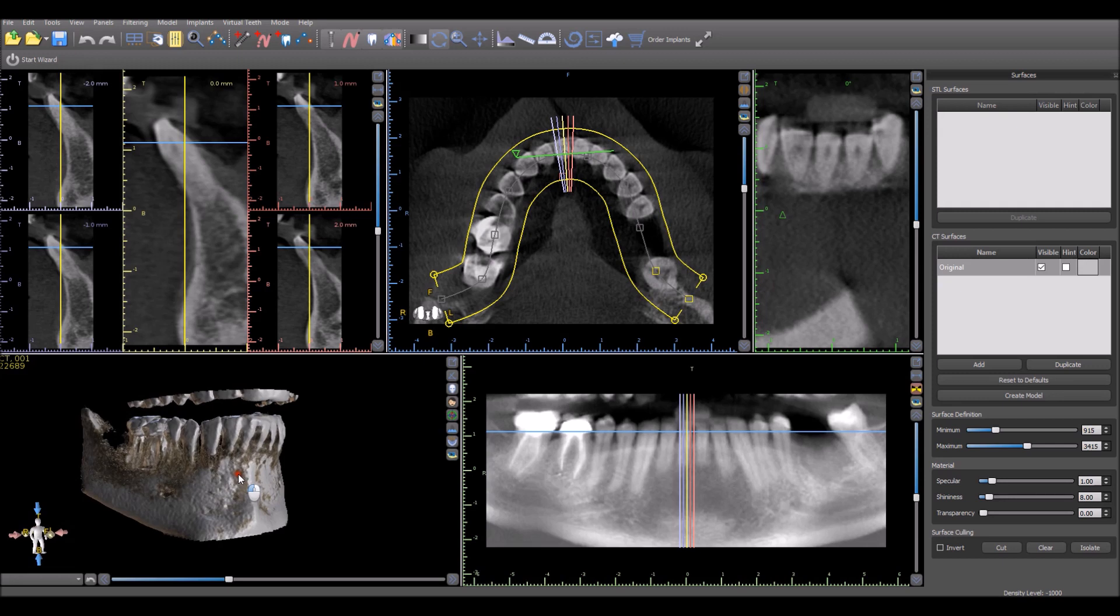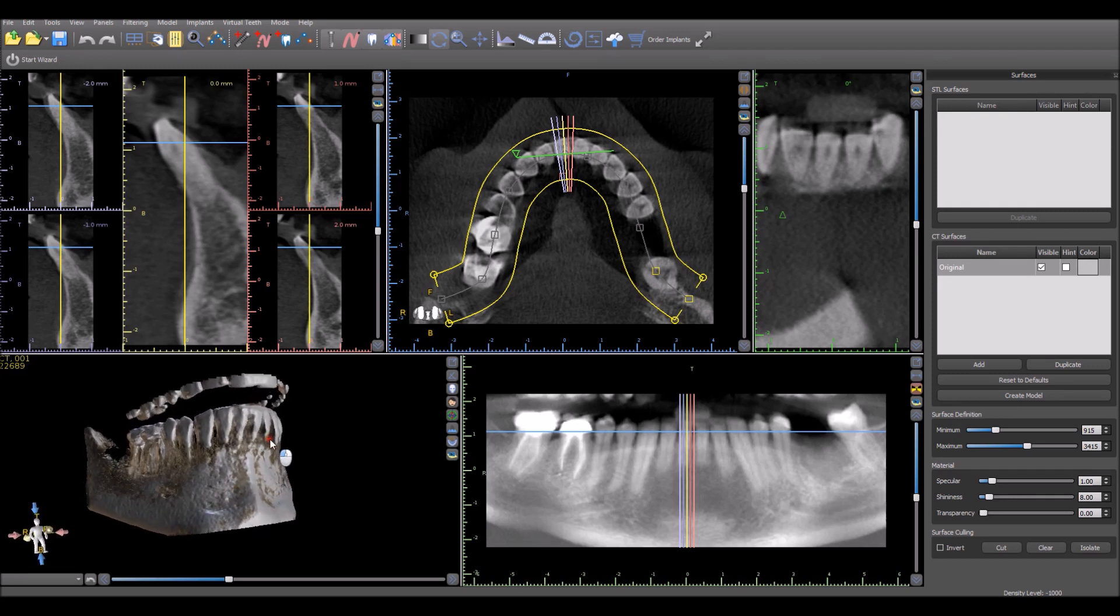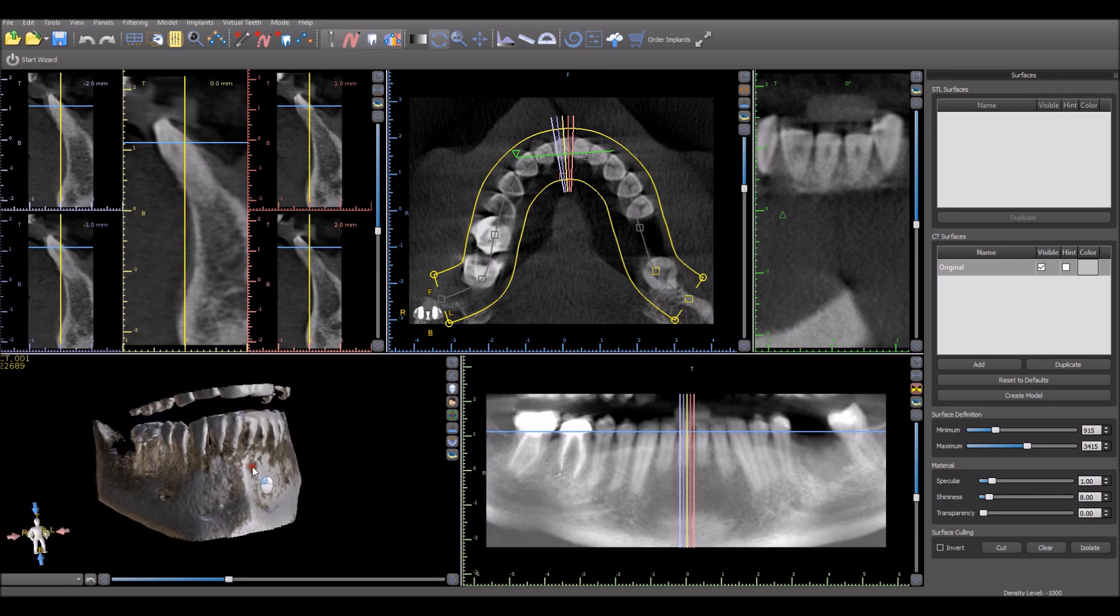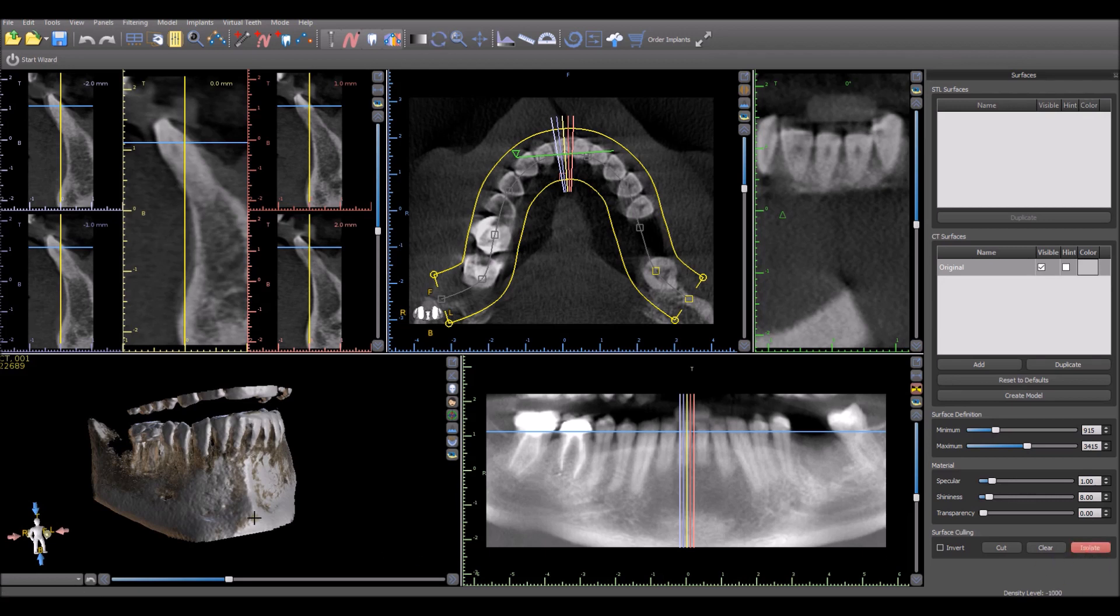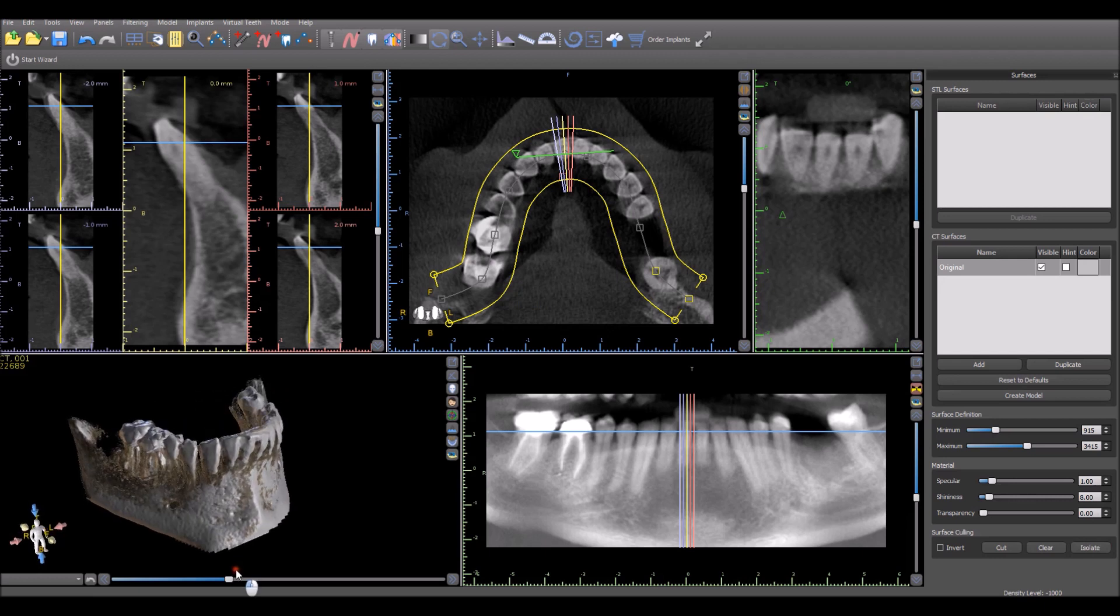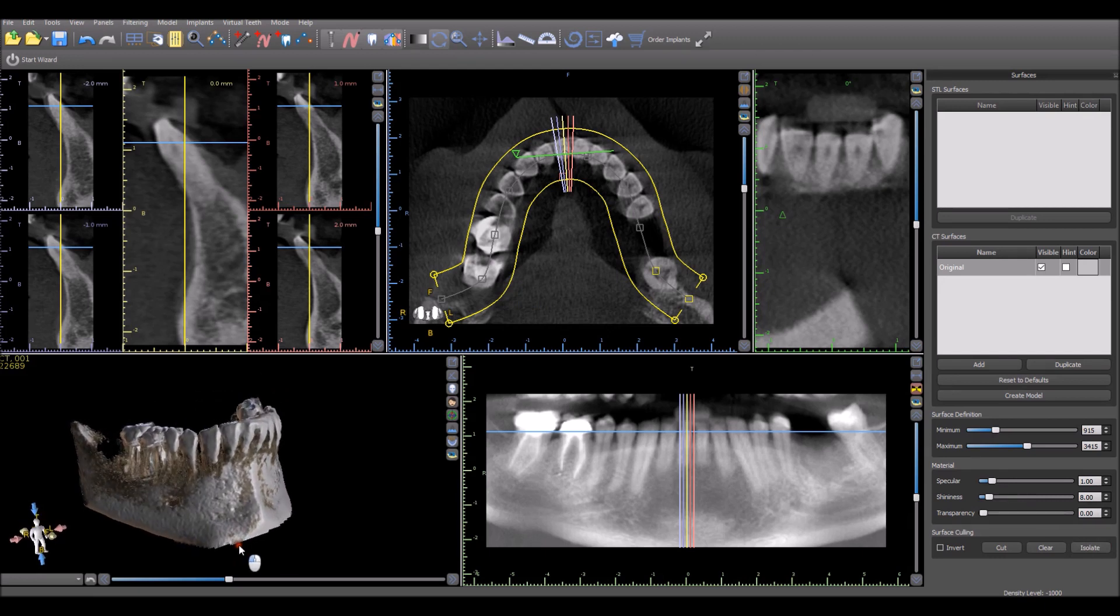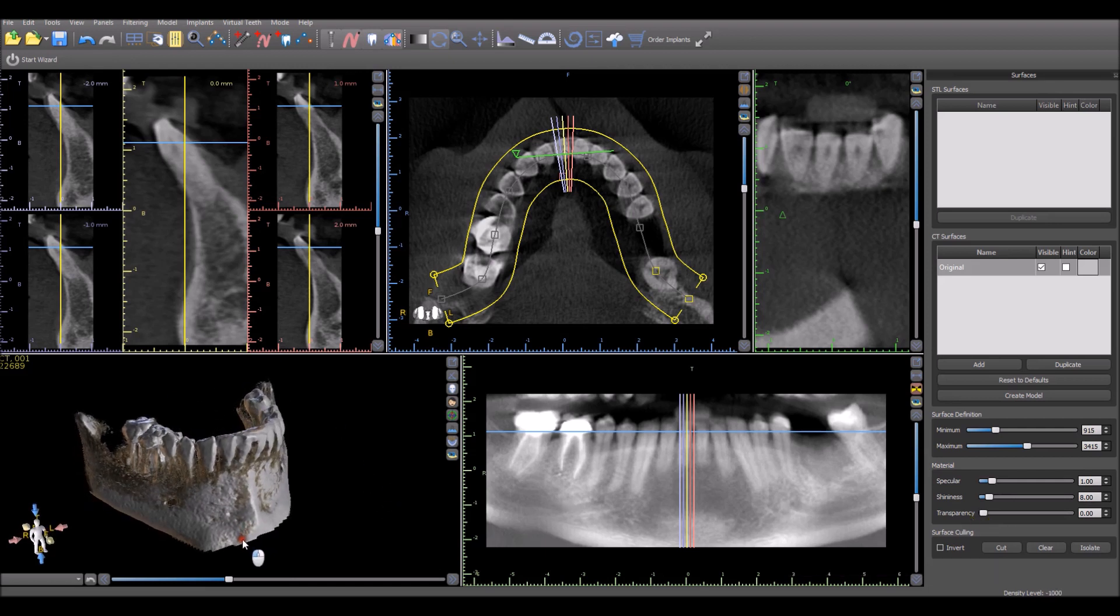If you want to clean up any additional scatter or parts of the anatomy that's not relevant, simply click on the Isolate button in the bottom right. Click on what you want to keep and anything not connected or touching to that part of the anatomy will be removed. You can also use the Cut functionality to create a lasso around the area that you want to remove.